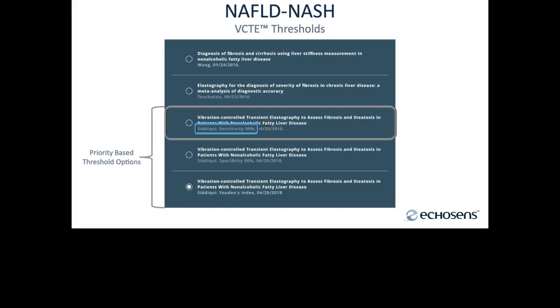Now let's move to the more complex topic of NAFLD-NASH and VCTE thresholds.